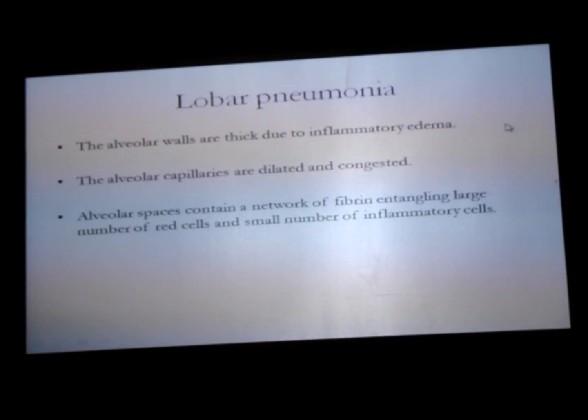So in any slide, you first try to identify the organ. If you see spaces like this, it is lung. Don't confuse this with thyroid. In thyroid, you will see colloid, pink secretion, and in thyroid only two slides are there: Graves' disease and papillary carcinoma, where you see many papillae and cells. In lungs, all empty spaces will be there. This is another slide of emphysema where ruptured alveoli form a big empty space. These are again alveoli. This is lung.